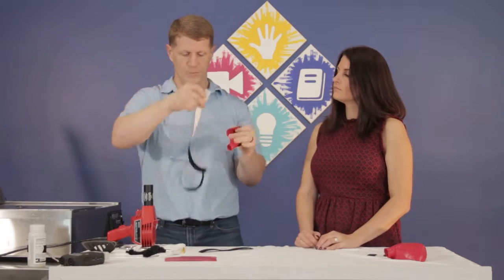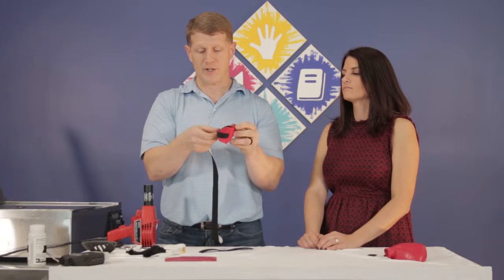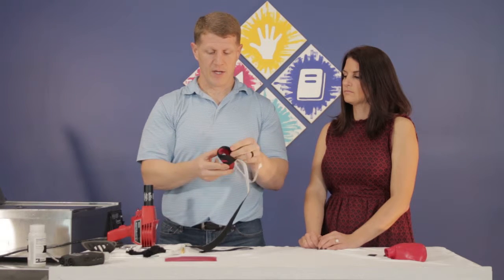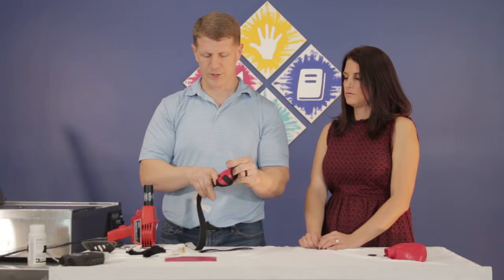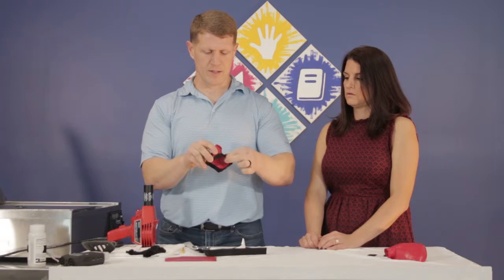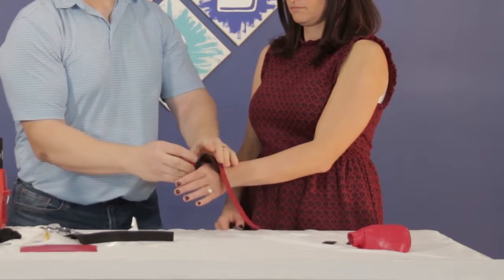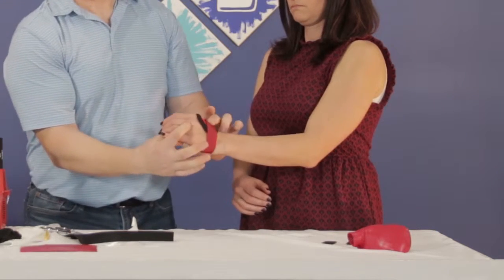Then we're going to take our edging — we talked about doing this especially when you're using perforated material. In Arizona, all we use is perforated material unless we need some rigidity because it's so hot here. That keeps me from ending up with a jagged edge. I like to put it halfway around there and then it matches those contours a little better. Then I round the ends of my strapping to make it look good, and we come down around the base of the wrist.